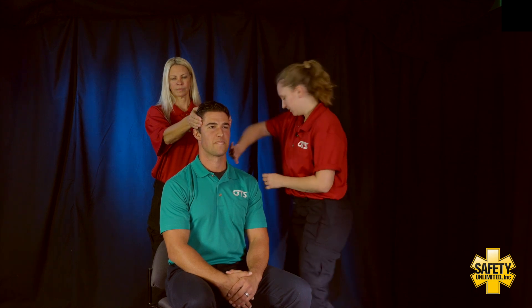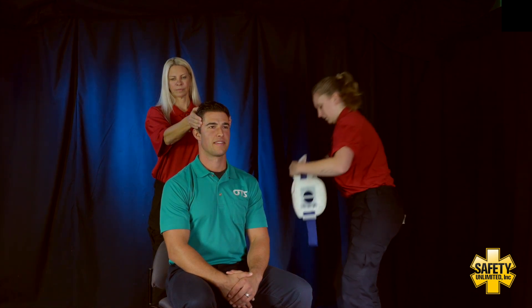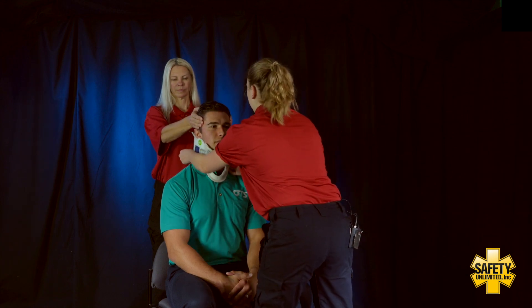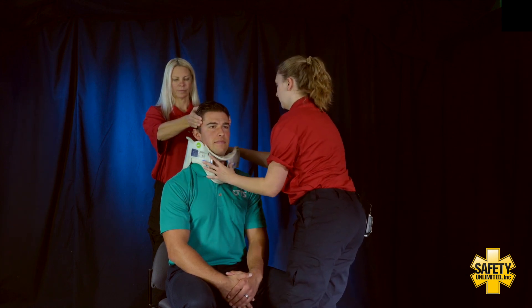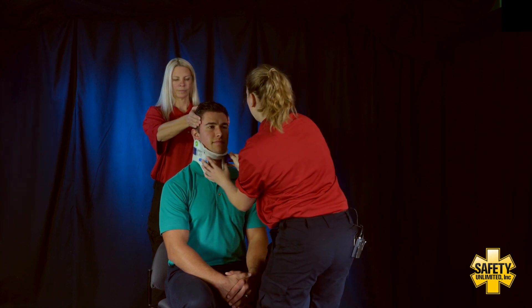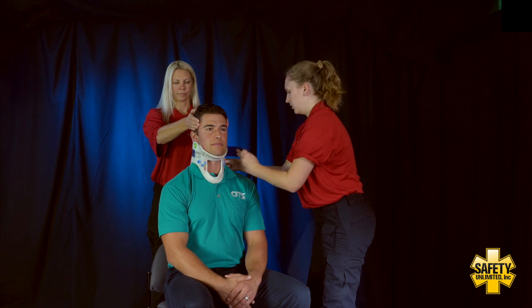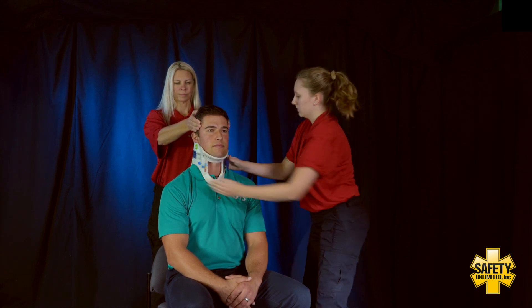Next, we're going to measure and size a C-collar. Making sure my partner is still holding that manual stabilization.